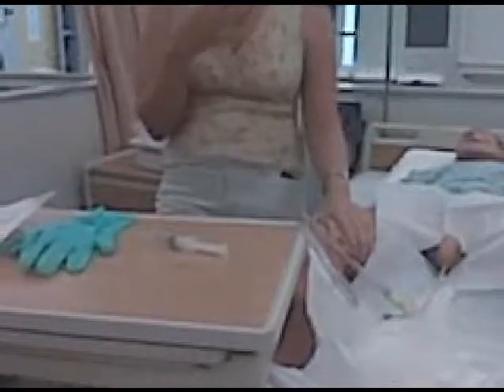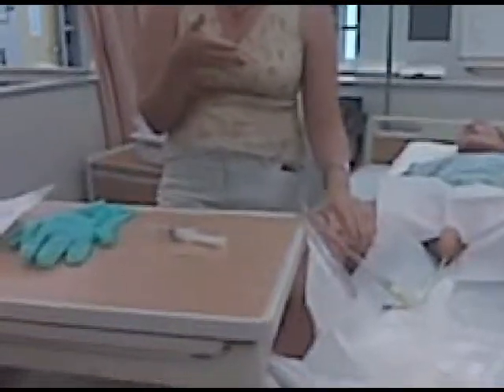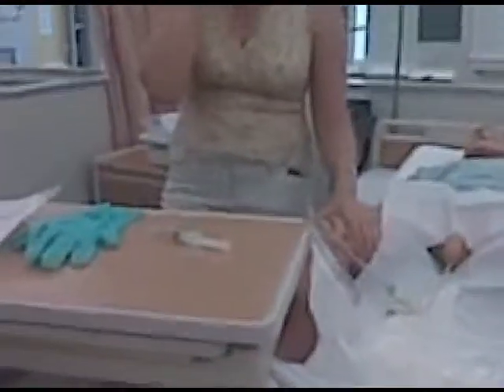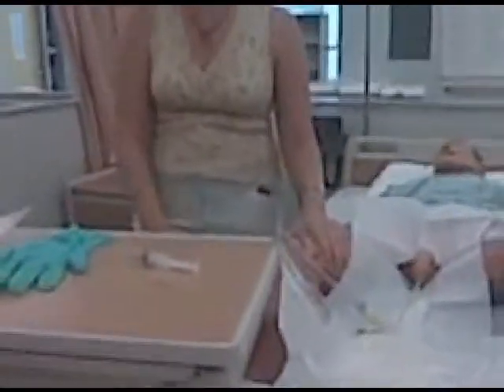You always get a little bit of urine? If the bladder is completely empty, you have a kidney problem. Okay, if the bladder is completely empty, you have a kidney problem, because even when you empty your bladder, you have a little bit. Yeah, in someone with functioning kidneys, you're going to hit some urine.